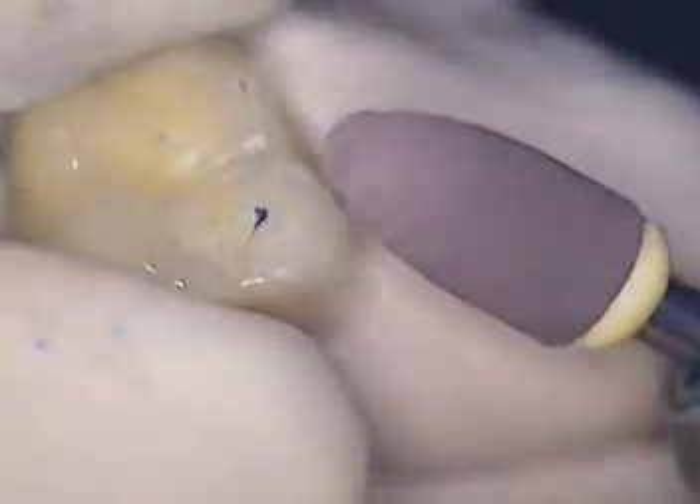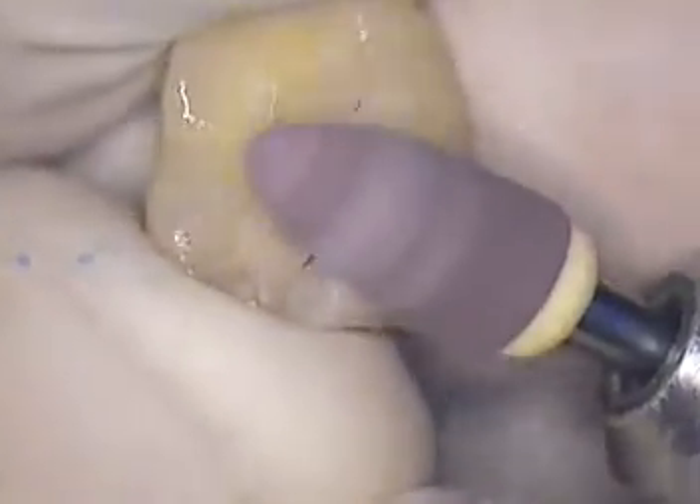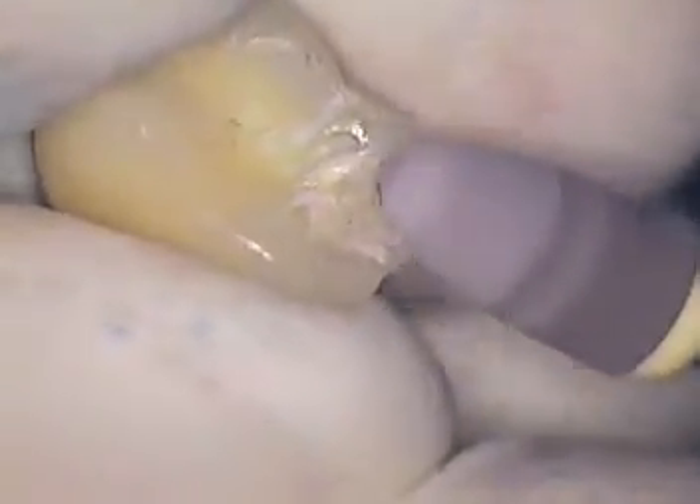We'll switch out to a pink polisher next. We're going through a definite sequence. It's kind of nice to polish these things outside the mouth — a little easier on our patient. We're going to see a definite change in polishability. We're going to use the gray next, and that should get us pretty close to where we want to be.